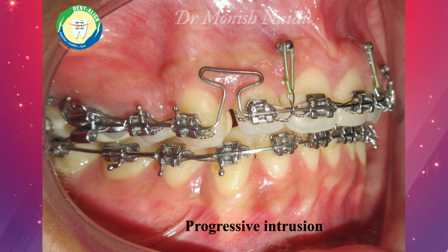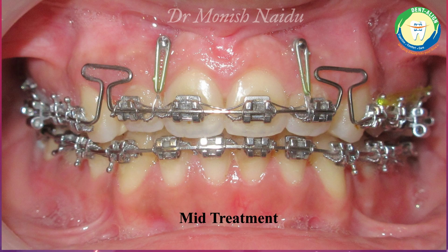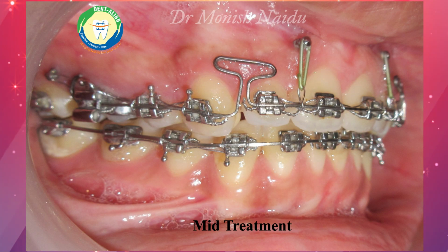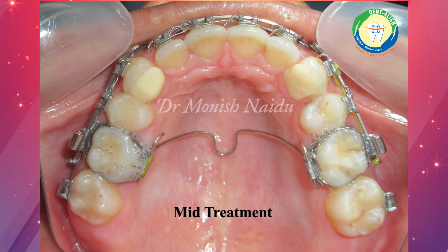We got a good amount of intrusion anteriorly. As we can see, there is a step now between the canine and the laterals. The lower incisor brackets are now visible, and the retractory forces, as you can see, there is a pull in the distal leg, the T-loop has widened, giving that retractive effect. So now our net vector of force was more intrusion and less retraction. But bear in mind, retraction was there, which has resulted in a significant closure of the gaps.